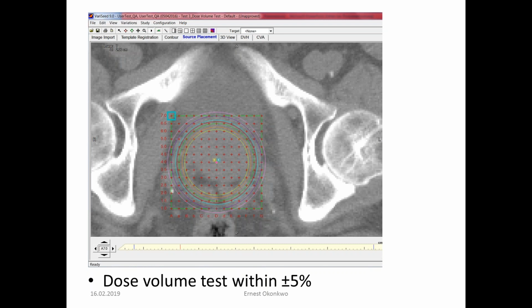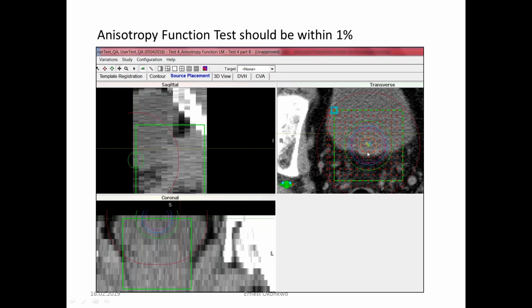With the anisotropy, just as Professor Hesser explained in one of his slides, most of these things you can do a hand calculation with the formula that he showed. At times, I recommend doing a hand calculation because it's quite easy to do, and it also helps to verify.